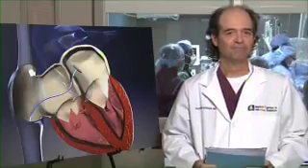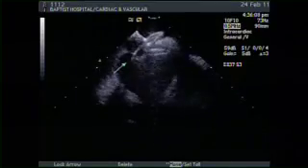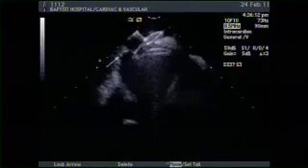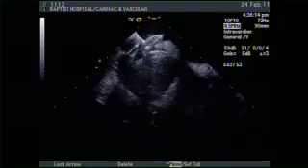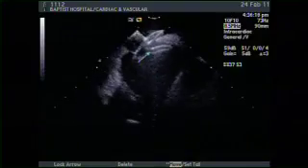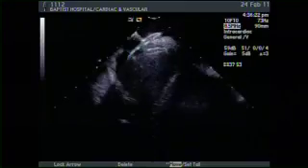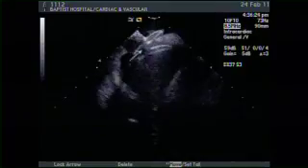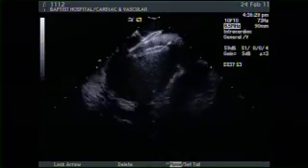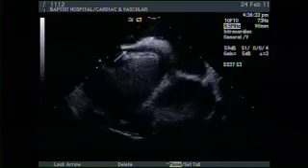Okay, can you show, please, the ICE imaging? So you can see here the image on the ICE. You have 2 discs. One disc is on the left side, where the arrow is, and the other disc is on the right side, and in the middle of that is the septum. You see the floppy septum moving, and you see the tunnel, and now we need to test that the device will stay there.